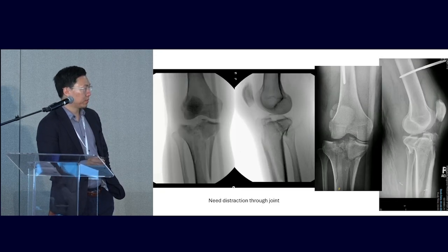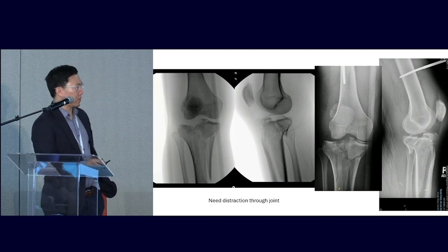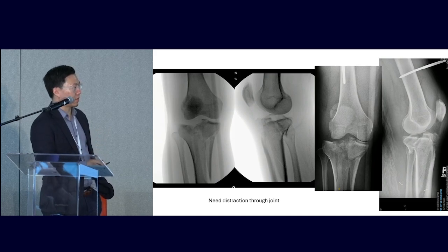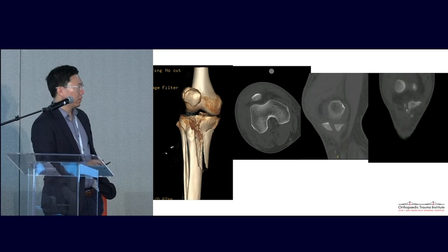Mark, did you put some type of traction behind the X-fix? I didn't do the X-fix here, but I think the one on the left is the intra-op, and the one on the right is the post-op. And the skin is still good everywhere? Yeah. Okay, I just have the CT here.